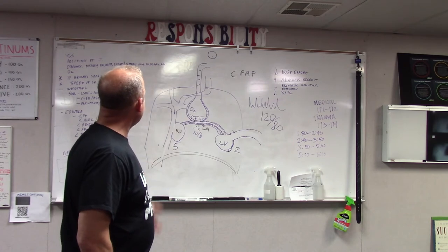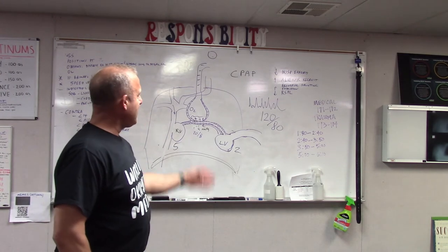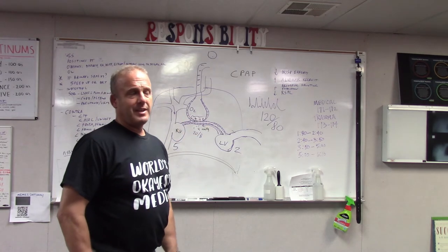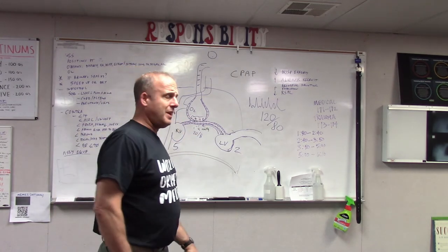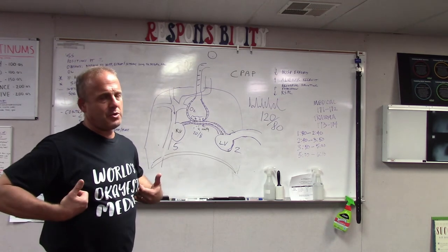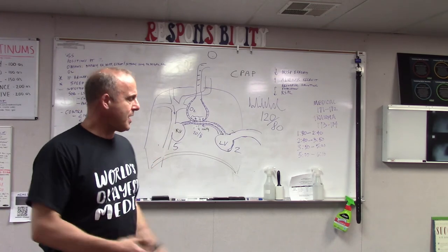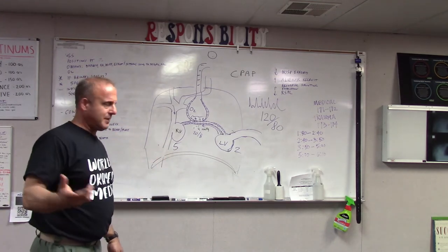And next thing is I want to see what their BP is. If their BP is super high like that, 180 over 100, 200 over 120, that's a slam dunk. I'll listen to the chest and I'll hear crackles. If I don't hear crackles because of the diminished air movement, I'll open up a bronchodilator. Now I can hear crackles. That's just kind of confirming things.